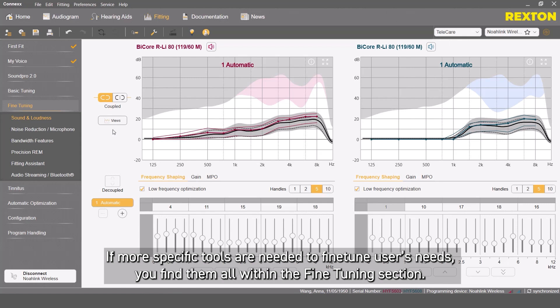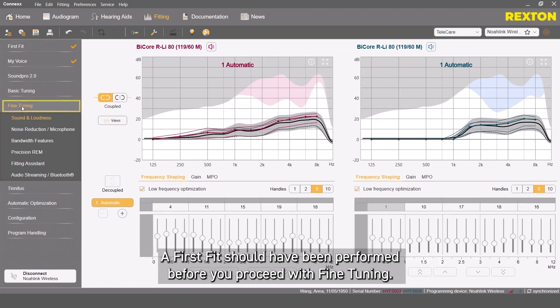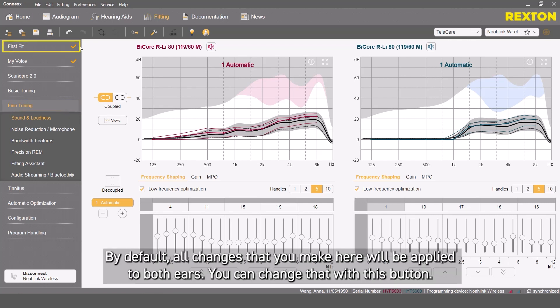If more specific tools are needed to fine-tune users' needs, you find them all within the fine-tuning section. A first fit should have been performed before you proceed with fine-tuning. By default, all changes that you make here will be applied to both ears. You can change that with this button.